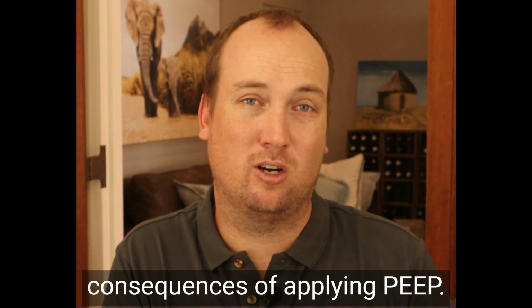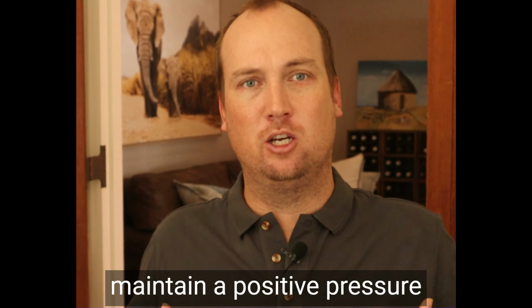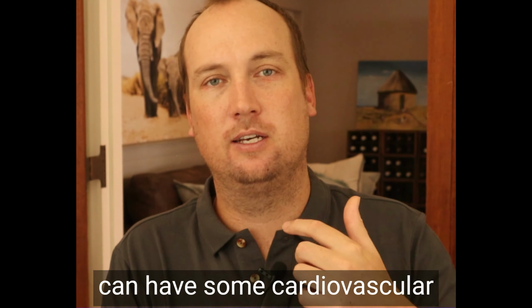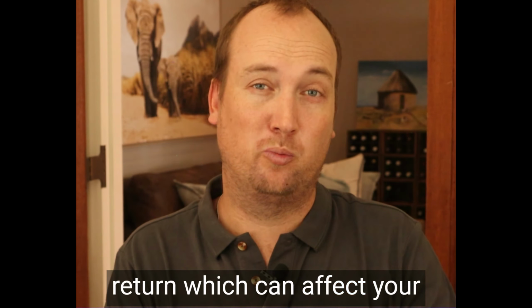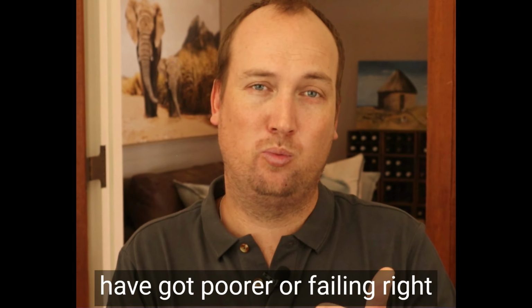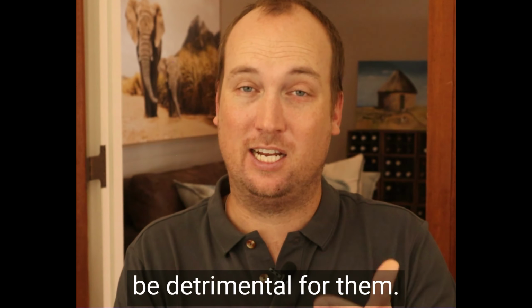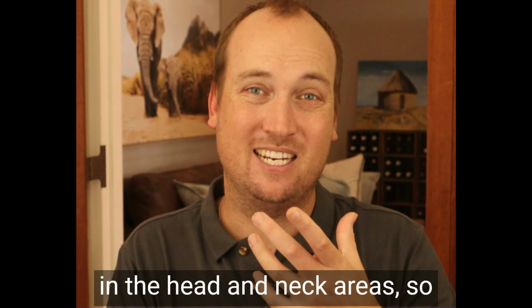There are some negative consequences of applying PEEP. So when we apply PEEP, we maintain a positive pressure within the thorax throughout the respiratory cycle. And that can have some cardiovascular effects. It can reduce venous return, which can affect your preload and your cardiac output. It can affect right ventricular function. So in patients that have got poor or failing right ventricles, the application of high PEEP pressures can be detrimental for them. It can increase venous congestion in the head and neck areas.